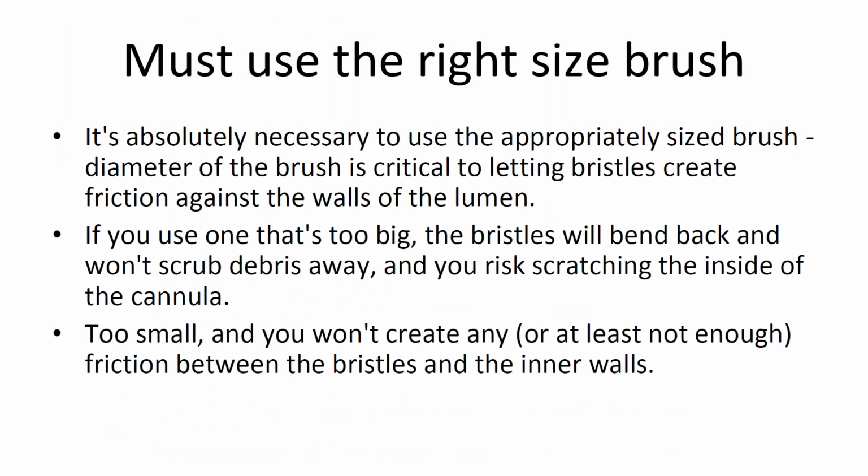And there is a recommendation for the type of brush that's to be used, and there is a channel marking on endoscopes to show what size channel it is. You can't use just one brush for all of your endoscopes. You have to know that it's properly sized in order to create the friction against the walls of the lumen of the endoscope to remove that debris. So if it's too small, you're not going to have that friction at the surface of the channel, and you will not scrub the debris off of the channel.